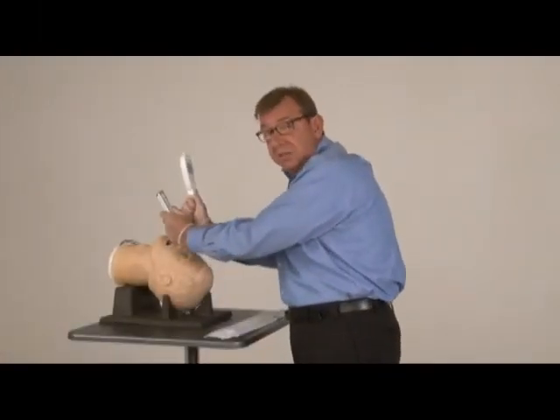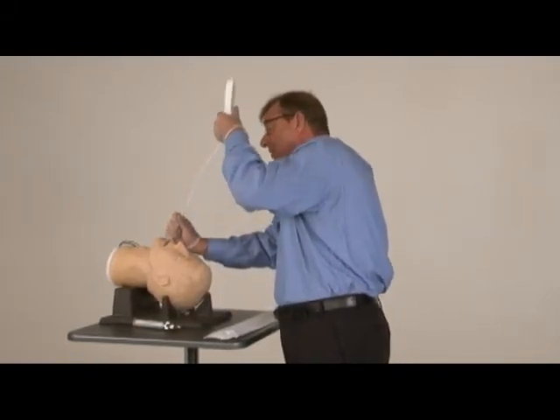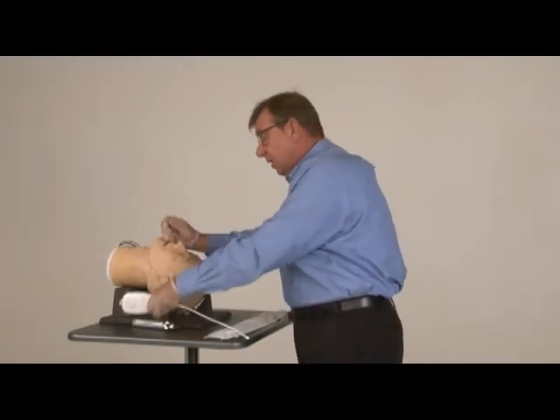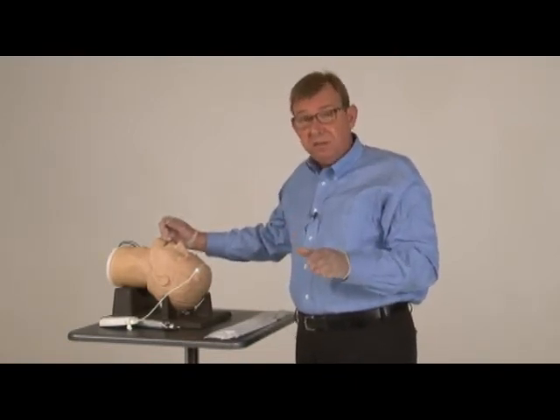Once you've seen the tube go through the cords, you remove the stylet, holding firmly onto the top of the ET tube connector so you neither lose your position or your connector. And then, of course, check it with your bag, auscultating both lung fields. And that's how simple and easy the ViewStick is to use.